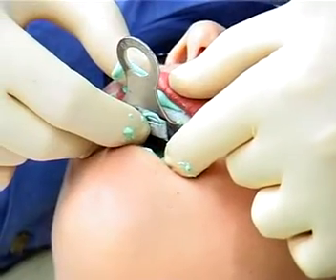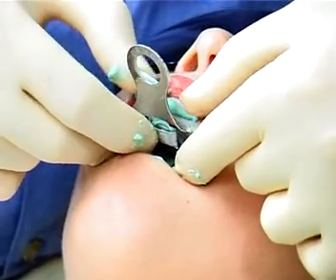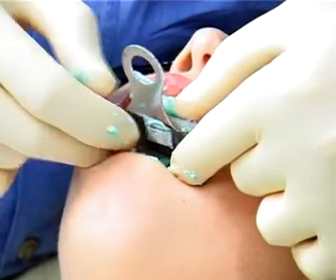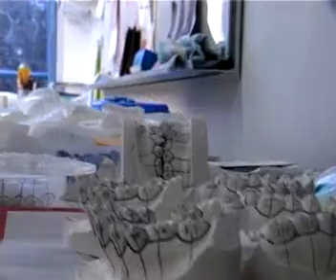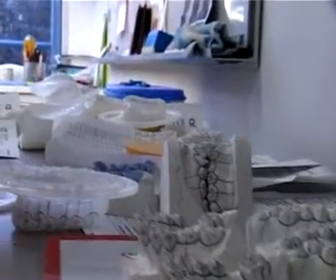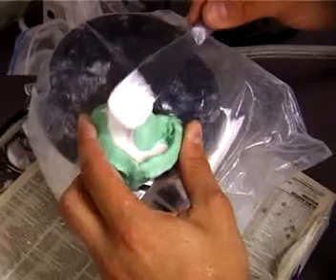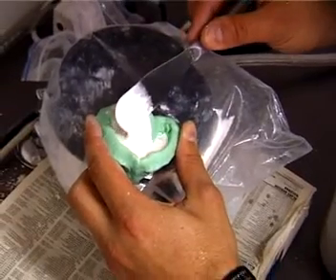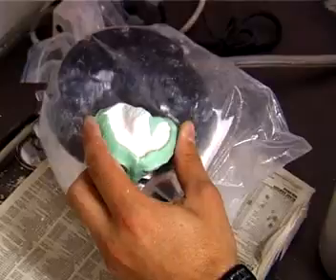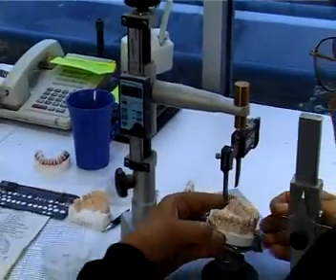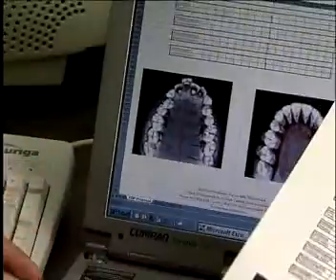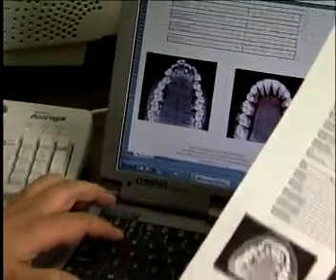After making an initial diagnosis and taking impressions of your patient's teeth, the impression is sent to the laboratory and poured into a stone cast. Specific measurements of the model are entered into a custom written software package.